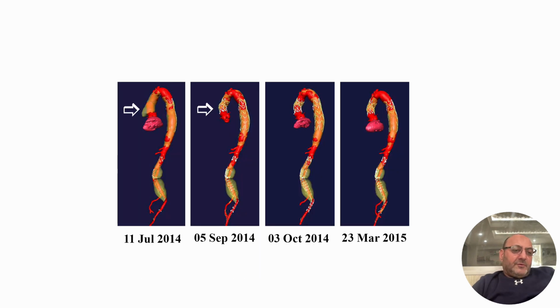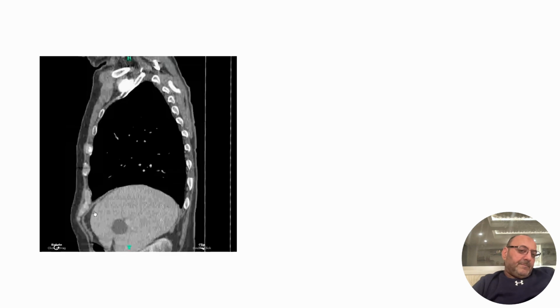You look at the follow-up for that first case that I showed you, and you see this is another case with the pseudoaneurysm. This patient came in with pseudoaneurysm where you see the arrow, and that was done in 2014. In July, 3 months later, you see it's remodeling, and then in 2015, almost the entire aorta looks pretty good at that time. So it's important to follow up on these patients, and important to have the tools to fix any problems that can come up at the time.